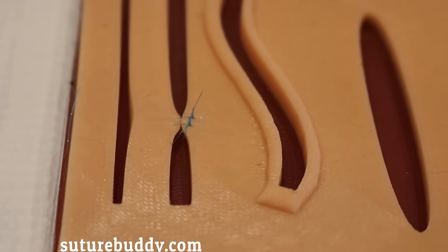Hey everyone, Dr. Rahimi here. Today we're going to do a quick video showing suture removal using a number 11 blade. We do have another video showing suture removal using scissors and forceps as well, so be sure to check that out.